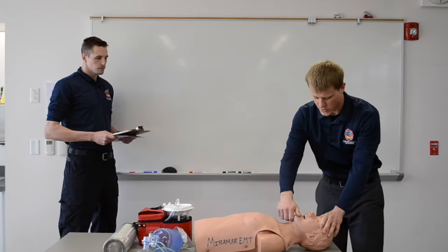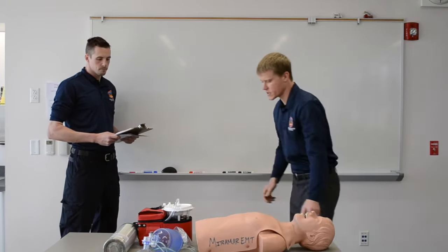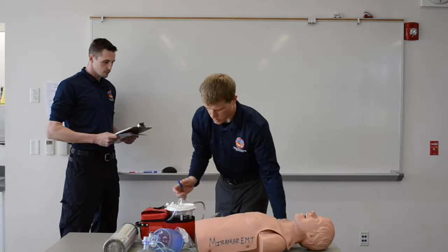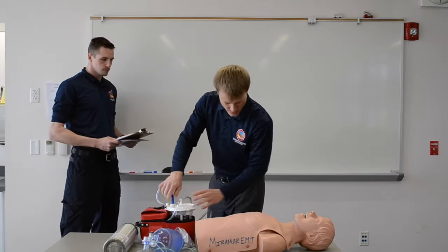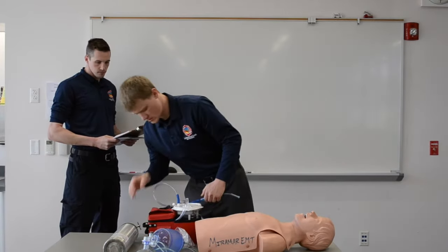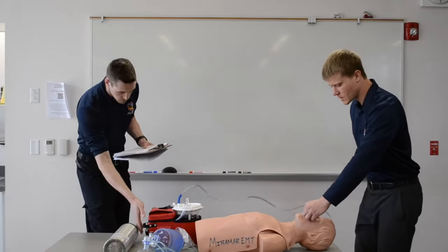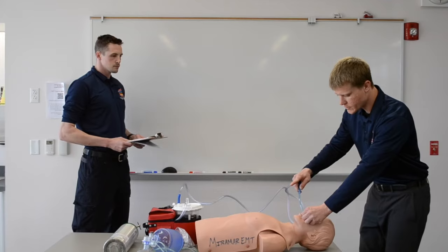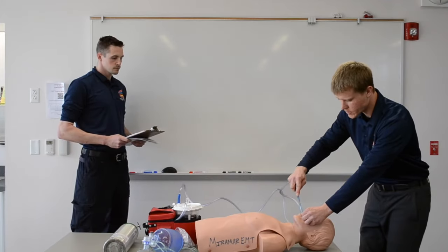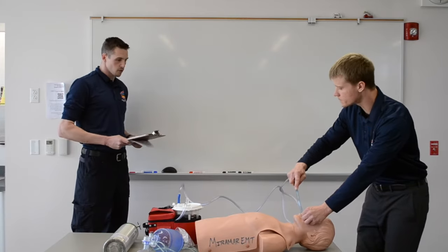We'll check the airway with a head tilt, chin lift. You see secretions and vomitus in the airway. We'll prepare our suction and grab our rigid tip suction catheter. Making sure suction is present, we'll use a cross-finger technique to open the airway. I'm suctioning only on withdrawal in a circular motion, no longer than 15 seconds, not to exceed the base of the tongue. The mouth and oropharynx are clear.